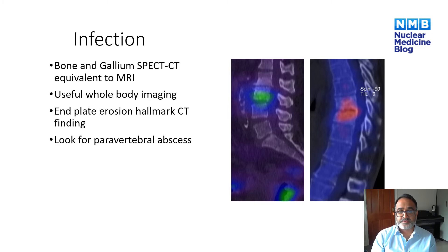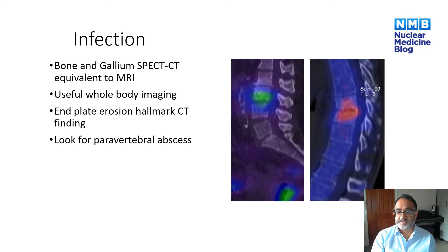SPECT CT is very useful in the investigation of discitis and osteomyelitis in the spine. Bone scans with SPECT CT have been shown to be equivalent to MRI in identifying discitis, and can be useful as part of whole body imaging when you want to exclude discitis in a patient with pyrexia of unknown origin. On the CT component, endplate erosion is a sensitive and specific marker of discitis, helping to differentiate it from degenerative changes. You should also look out for paravertebral abscess, which can be picked up on the non-contrast CT component.